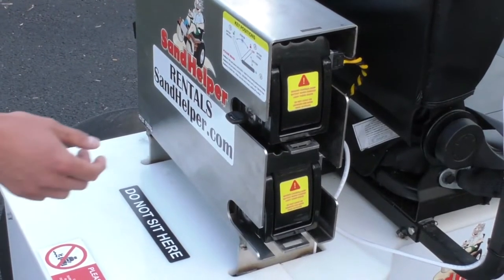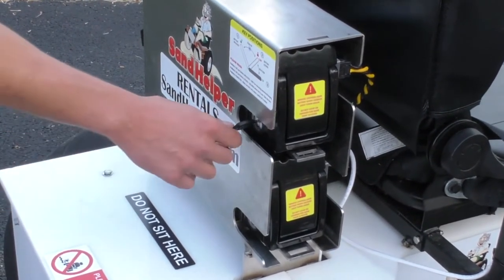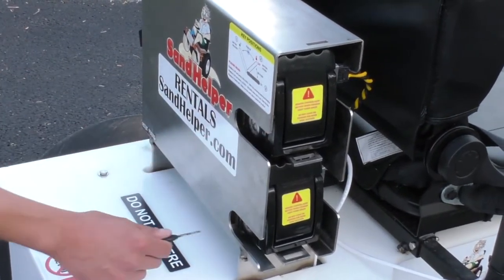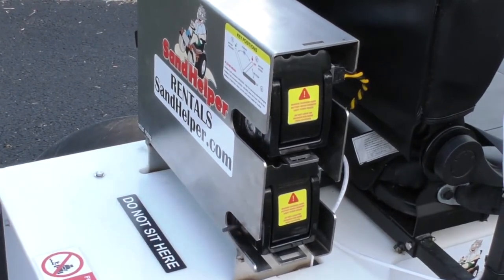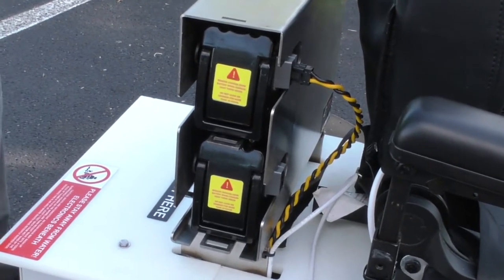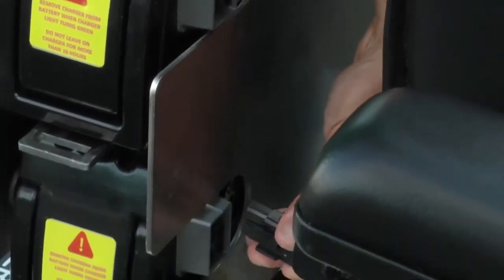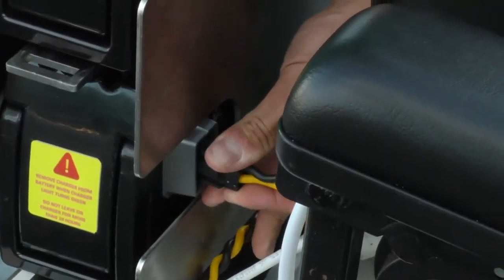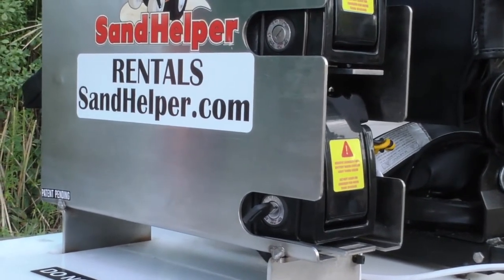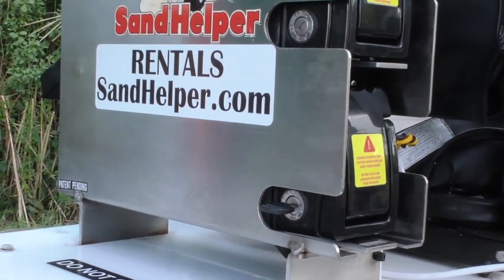First, turn the wheelchair off by turning the key one click counterclockwise. From the off position — shown on the diagram on the back of the wheelchair — you can remove the key and move it down to your backup battery. Once you've done that, unplug the power cable from the battery you were previously using by pushing in on the clip and pulling out, then plug that cable into your other battery. Now that you have the power plug and the key in your backup battery, turn the key one click clockwise to turn on the wheelchair.